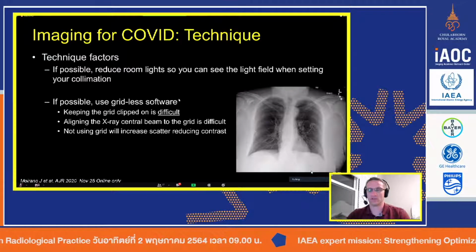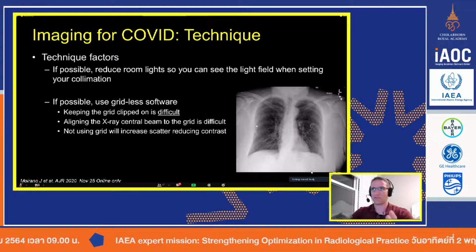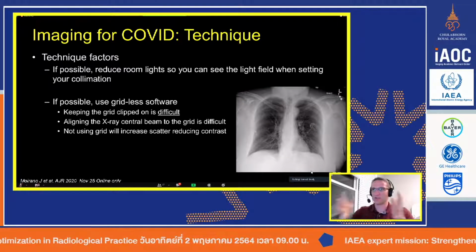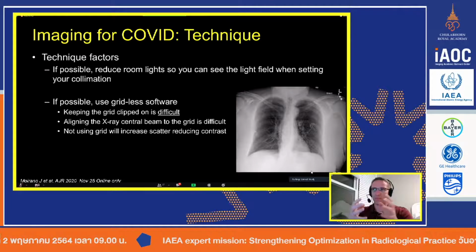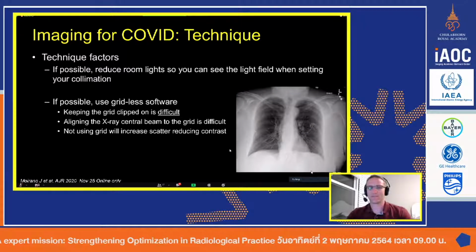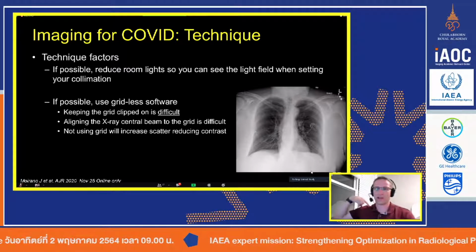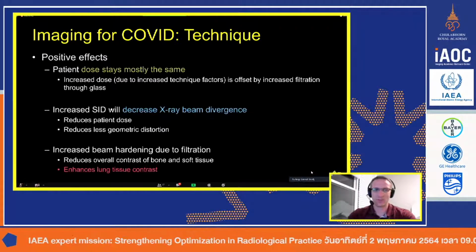In a perfect world, you will still do your best to get the tube as aligned as possible to use the grid because you'll get better image quality. But if you cannot guarantee a good perpendicular, or if the grid won't stay attached once you put it in the bag and could come unseated from the detector, or if the patient has to hold it and it's hard for them, then you're just not going to be able to use a grid. Now, if you are going into the room and placing it under the bed, under the patient, then you can still do a grid. If they're sitting in a wheelchair and you're putting it behind their back, you could probably use a grid as long as you can get it as well positioned as possible. So do your best with the grids.